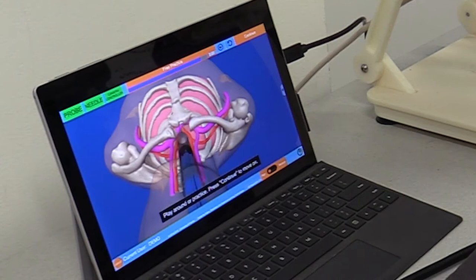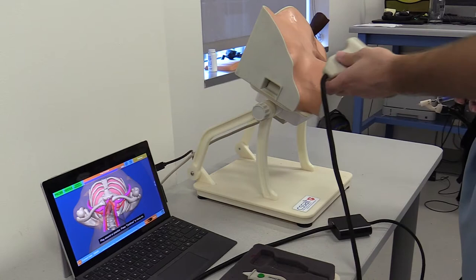The simulator allows for six degrees of freedom: XYZ, yaw, pitch, and roll tracking with sub-millimeter accuracy of handheld instruments made possible through Ascension Technology Corporation.